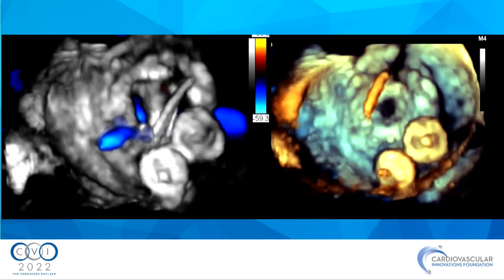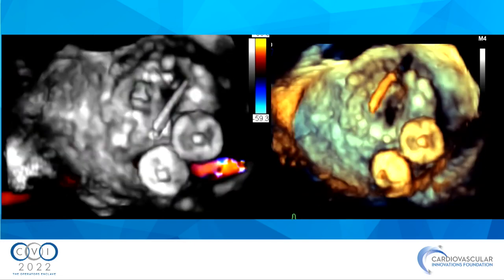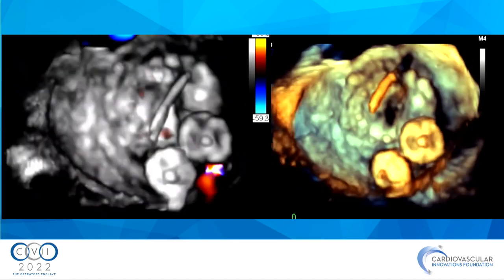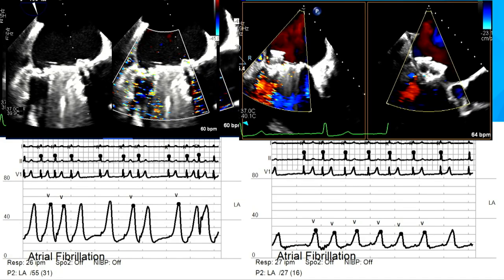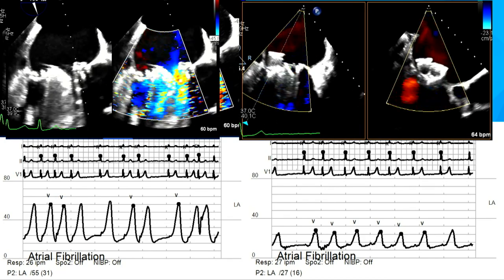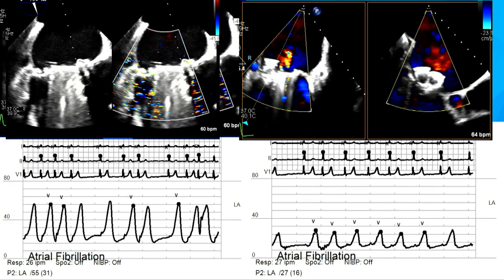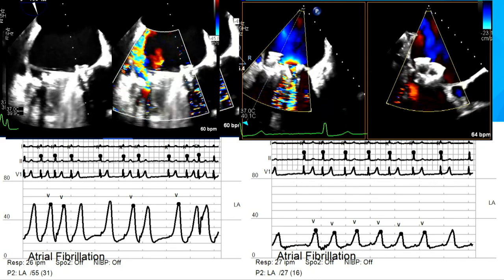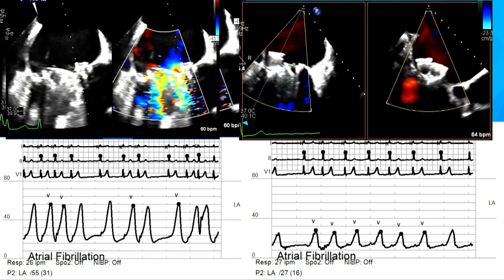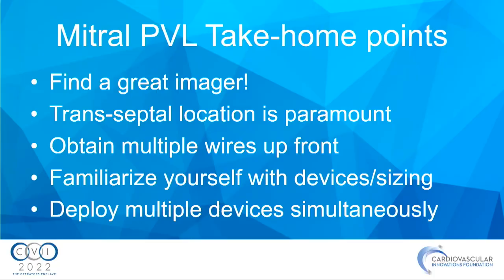And the thing for me was, I always like the pictures that our imagers give us, so I try to show them off a little bit. But really not much leak on the left screen when you show color there. And then the hemodynamic result was very favorable. Patient has done incredibly well. If you look on the pictures up on the top, the pre-image just to remind you what it looked like at baseline with the giant V-wave, and then on the right side of the screen, a much improved paravalvular leak with significantly improved hemodynamics.